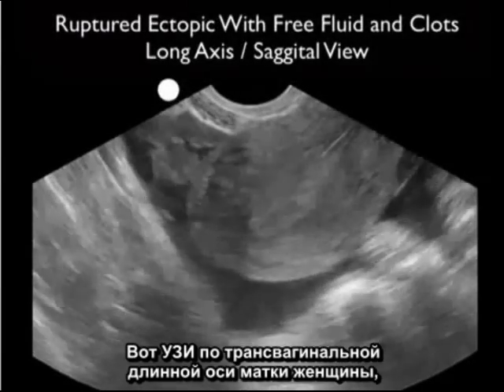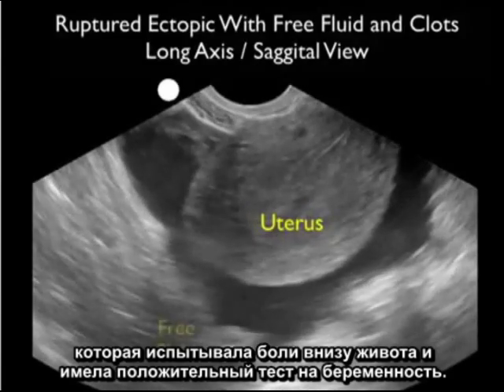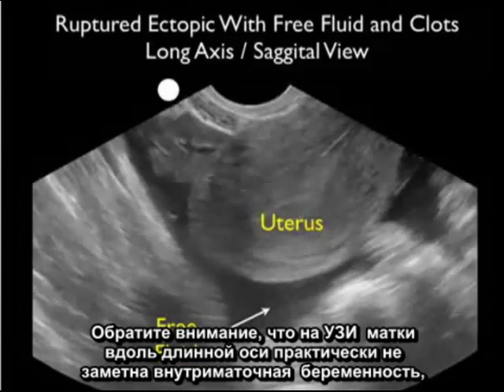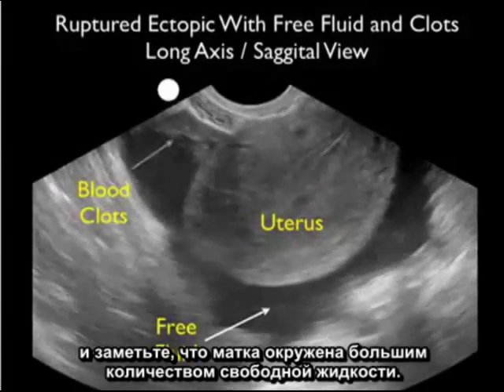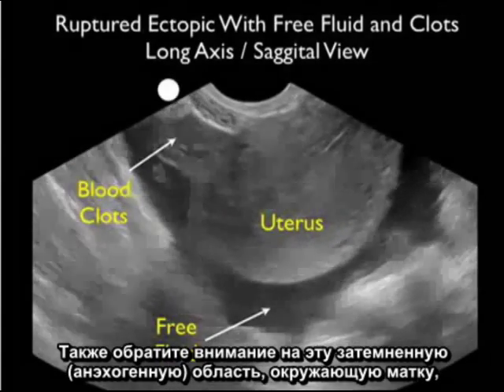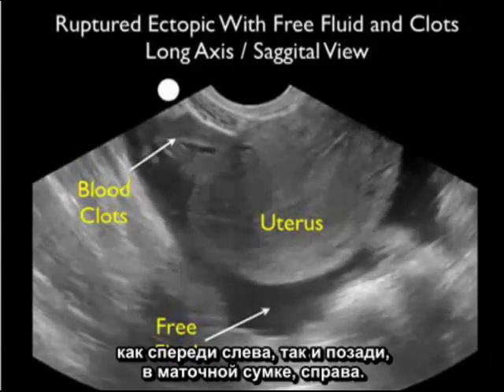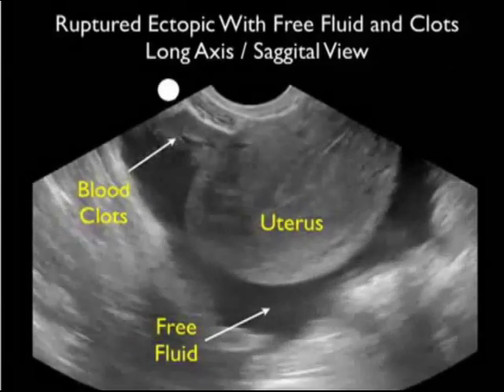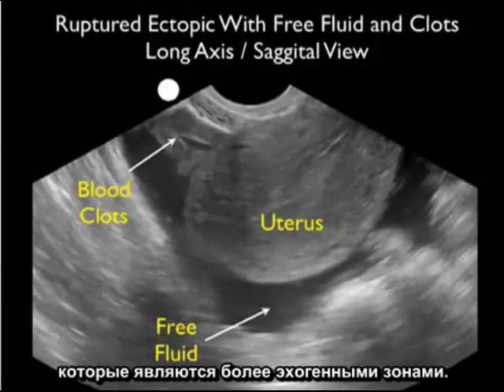Here's a transvaginal long-axis ultrasound from a woman who presented with low abdominal pain and a positive pregnancy test. Notice the uterus in the long-axis view without an appreciable intrauterine pregnancy. Notice that it's surrounded by a large amount of free fluid — that dark or anechoic area surrounding the uterus both anteriorly to the left and posteriorly in the cul-de-sac to the right — representing fresh blood. Notice also the presence of blood clots anteriorly, that more echogenic area.